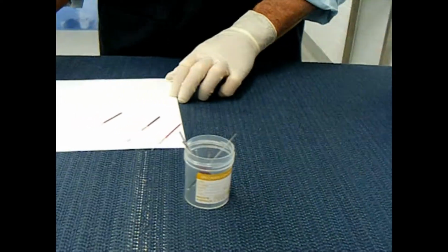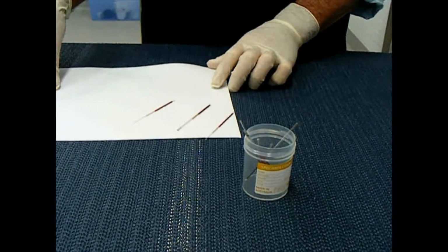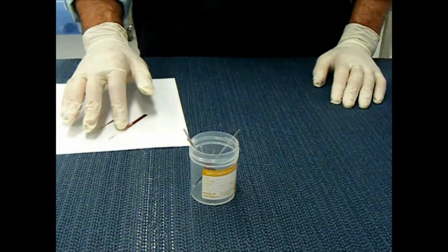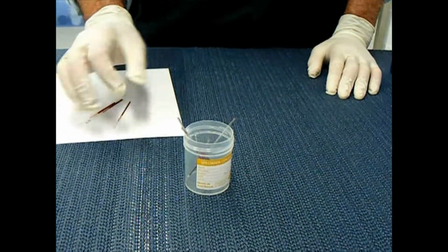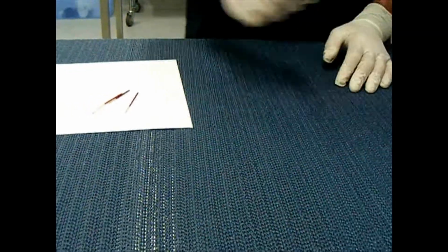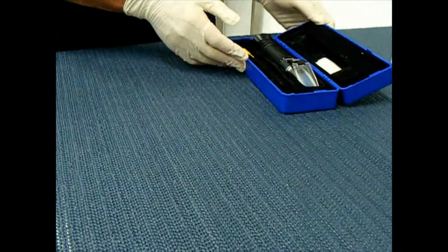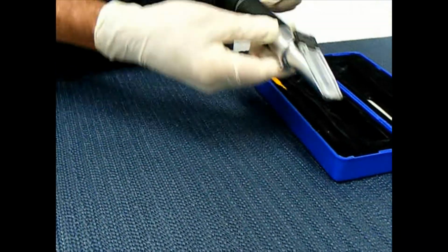Okay, I've measured the PCV and I've finished doing those measurements. So I've got my tube still. We're going to move on to the TPP now. The TPP is the total plasma protein. To measure that, we need to use the refractometer. So we had a look at the refractometer the other day. This is the refractometer.